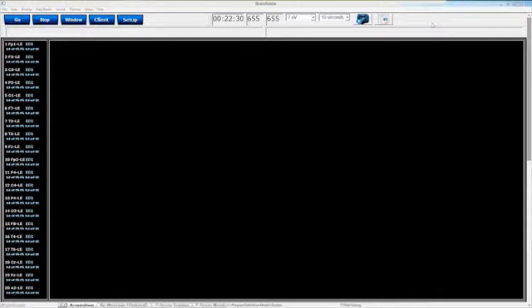I mean, yeah, that's perfectly capable as far as a feature goes. One of those functionalities is, once again, in standards training you don't have. But yes, in Event Wizard, you can absolutely do a play MIDI sound when it's less than, and have some annoying noise, percussive, that hurts the ears to prevent them from doing that. Sure. Criteria from a qualitative standpoint is used for an inhibit versus a reward sound.